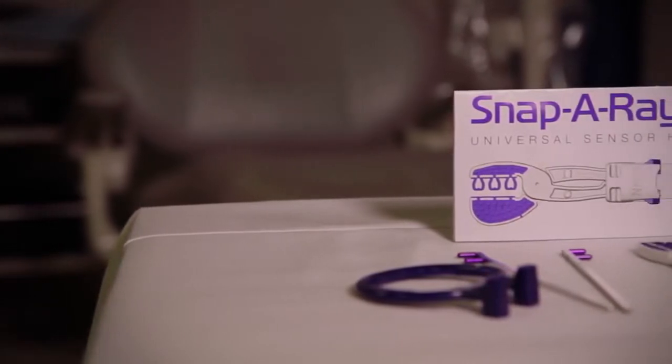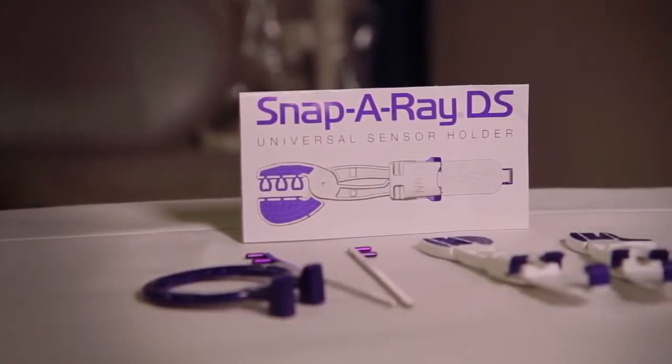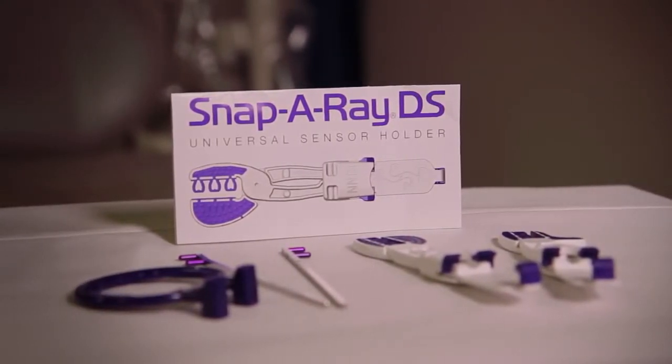Some of the most challenging x-rays are taken during an endo treatment. The working images needed need to be placed behind the rubber dam, which can be very, very challenging. What I'd like to show you today is how to assemble the Snap-A-Ray DS and show how it can be placed behind a rubber dam and also include the apex of the tooth.